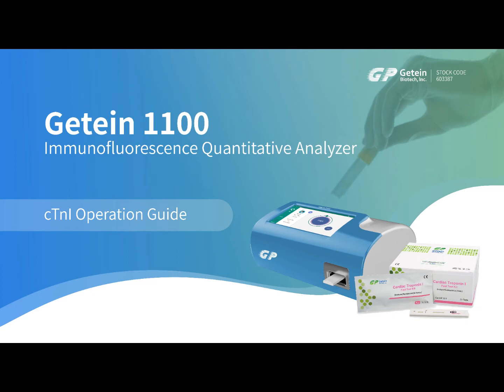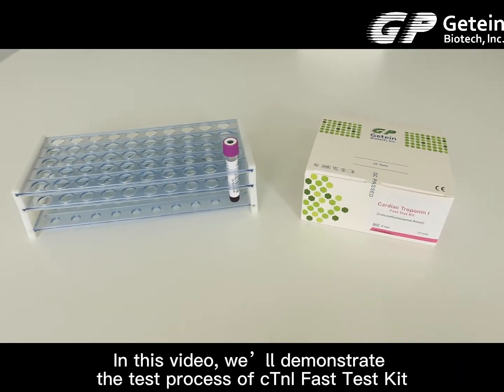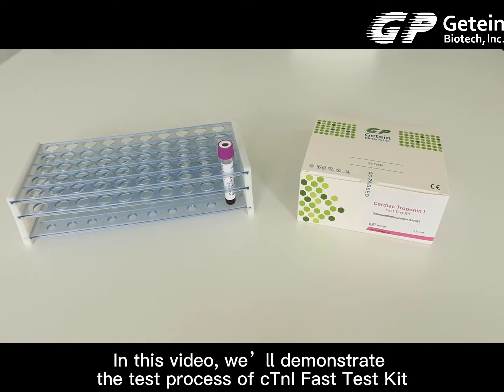Getein 1100 Immunofluorescence Quantitative Analyzer cTnI Operation Guide. In this video, we'll demonstrate the test process of cTnI Fast Test Kit.